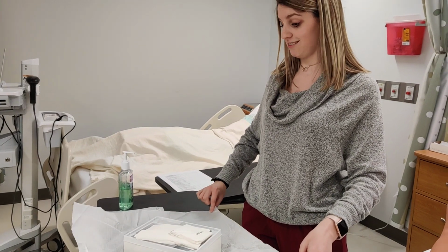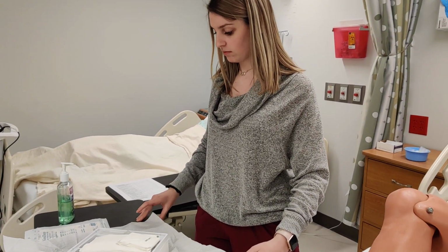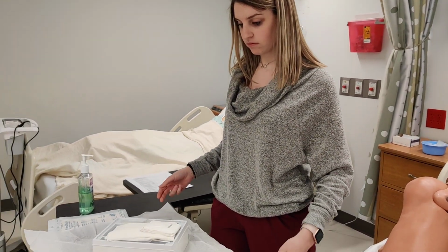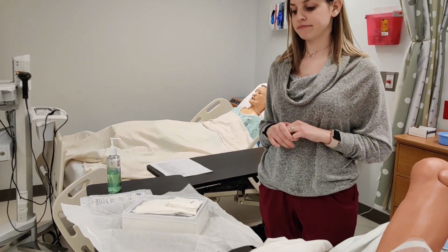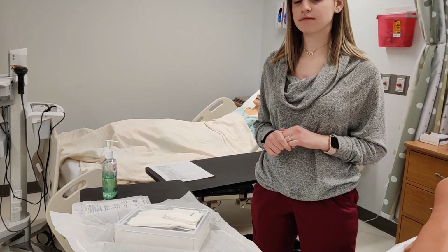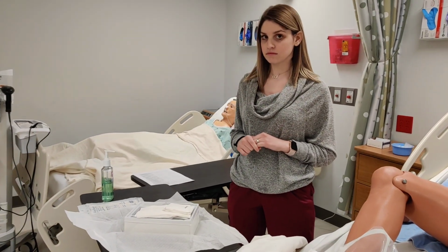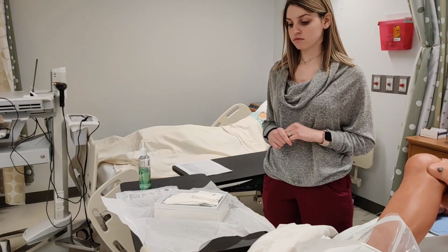They like to fight, guys. So something just to mention, when you've touched the wrapper and it flops back into the kit, that's a contamination. All right, we're going to keep moving forward. We're going to say Gabby didn't contaminate, but just so you're aware that when that paper does flip forward, we like these mistakes to happen because we want you to see that that would be where a contamination can potentially happen.